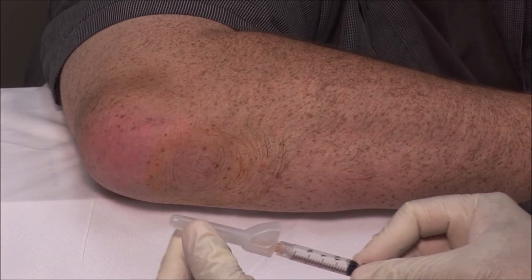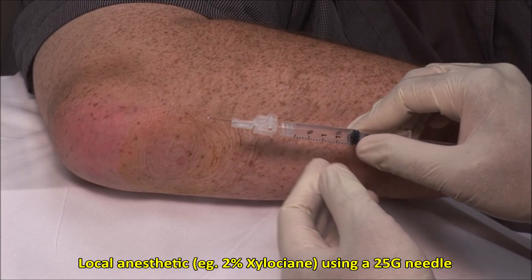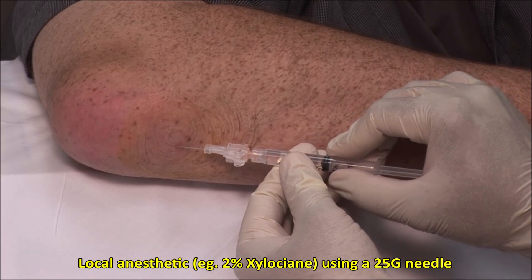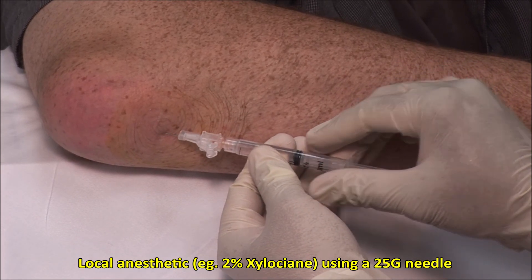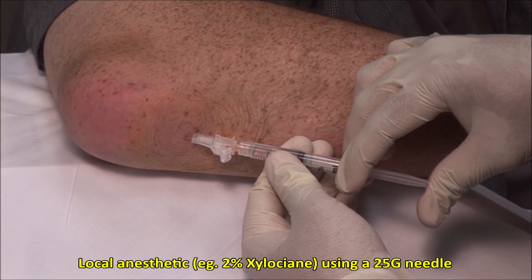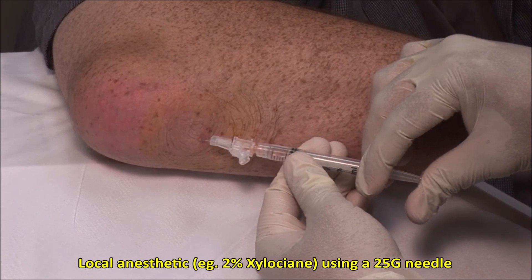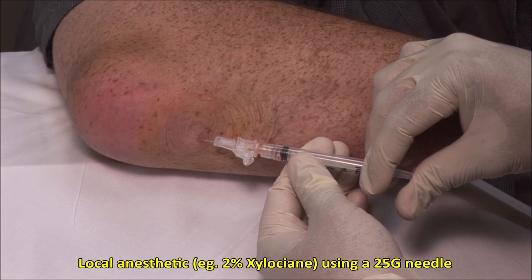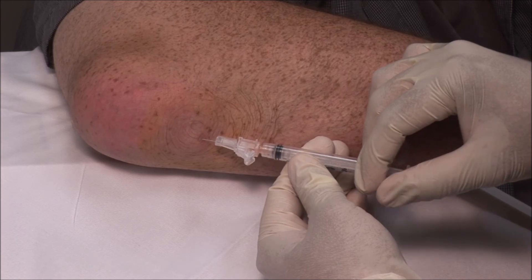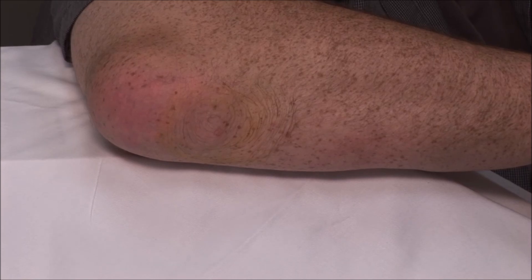Using a 25 gauge needle, apply local anesthetic subcutaneously and towards the bursa. You can use 1-2 mils of 2% xylocaine. Give this a couple of minutes to take effect.